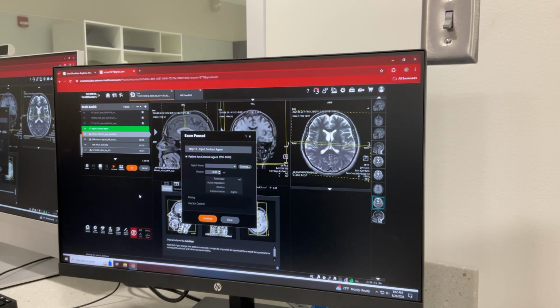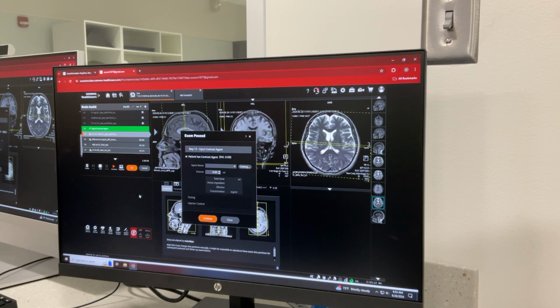If you were going in, this is when you would pull your patient out of the scanner. Just make sure you never re-hit that landmark button, because once you put that laser light back on to re-landmark them, all of your images are gonna go away. Now, they're still saved, they're not deleted, but they're going off of your screen, so you don't have them there for your planning purposes. That's just a tidbit. When you bring a patient out of the scanner, just don't hit the landmark. Turn the laser light on. At least for Siemens, that's how it works.